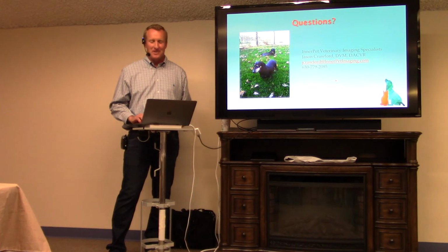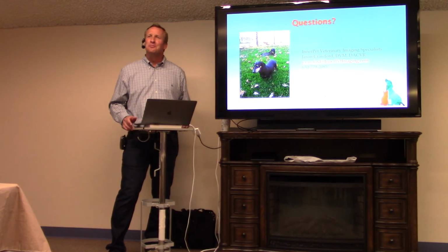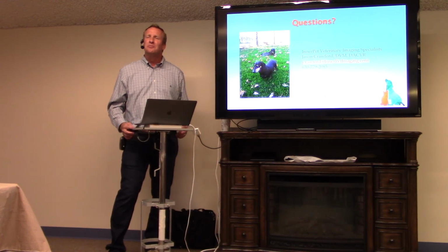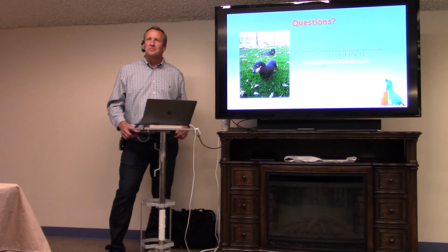All right. Thank you very much. I'm going to have at least one question, so I'll ask it. Sure. Over the course of your career, last 15, 20 years, do you feel like there's an increased client demand and acceptance of CT, or is it static, or even from the perspective of how do we promote it a little bit more in primary care and especially emergency care? Like what are your thoughts on that?